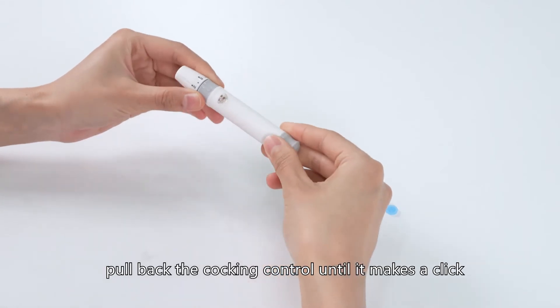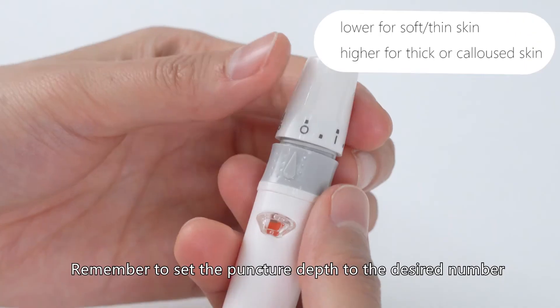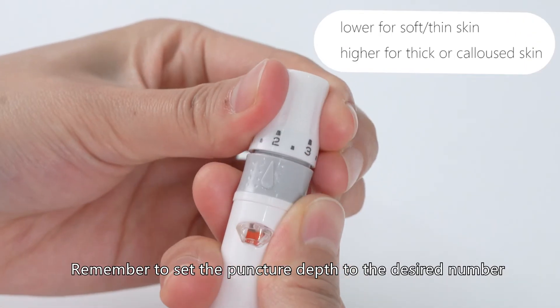Pull back the cocking control until it makes a click, and then release. Remember to set the puncture depth to the desired number.